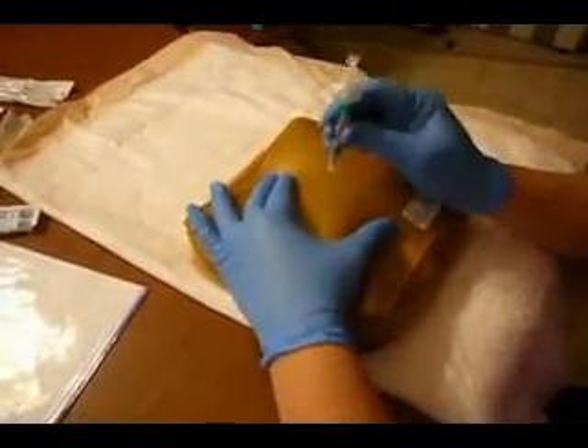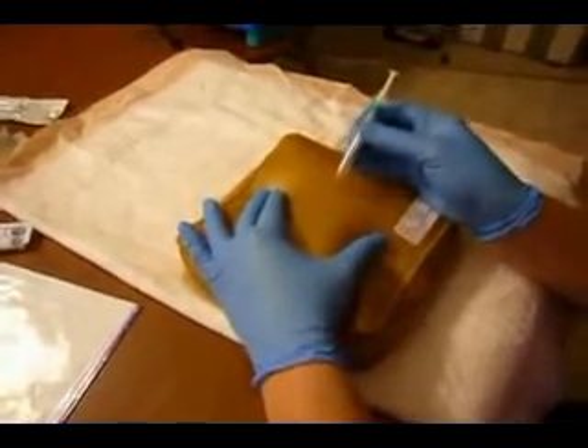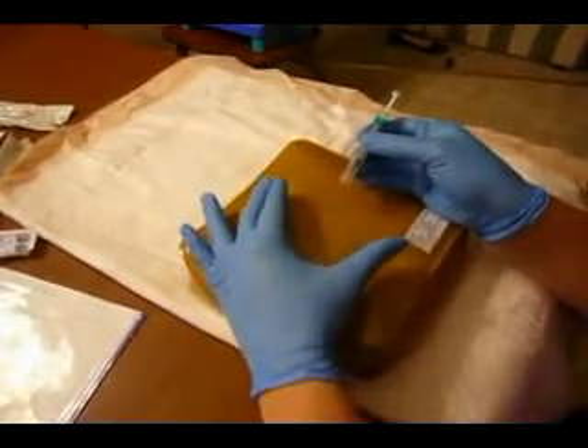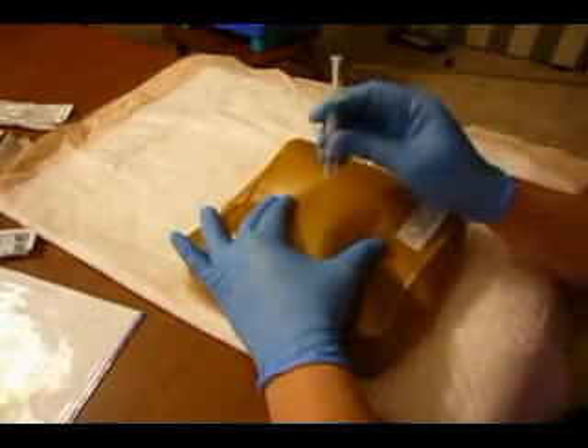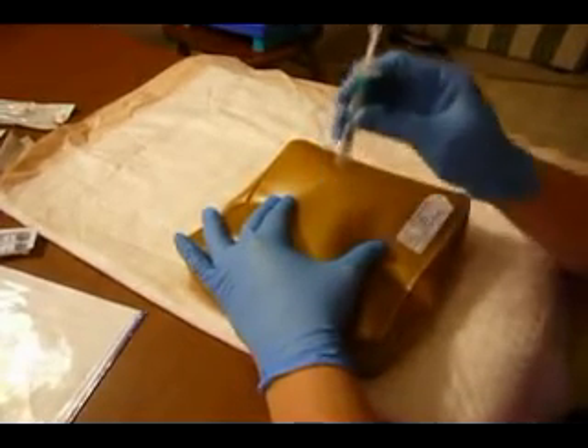Now the subcutaneous injection will either go in at 90 or at 45 degrees, depending on the patient's subcutaneous fat layer. If you're going to lower the angle from 90, make sure that you're always parallel to these two fingers. My patient definitely has enough subcutaneous tissue, so I'm going at 90 degrees.